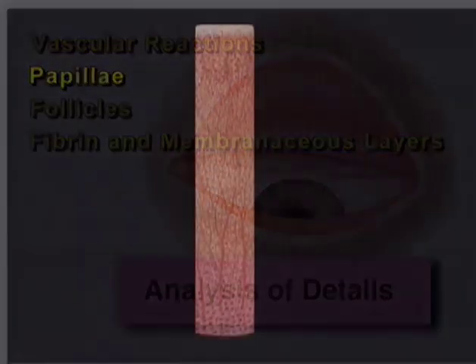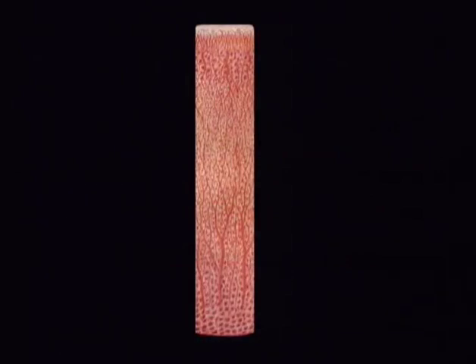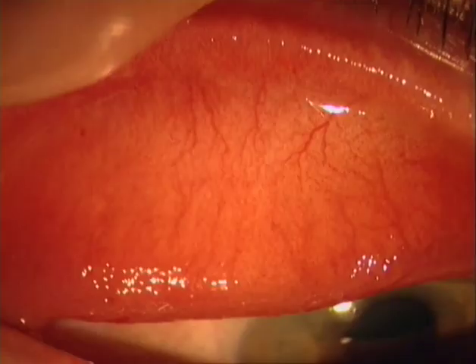Papillae. Papillae form compartments which contain a central core with a capillary bud, a rim of more or less transparent tissue, and are separated by deep furrows. In practice, the papillae are not always distinct, and we must look for other signs.